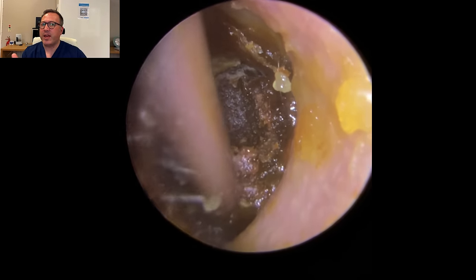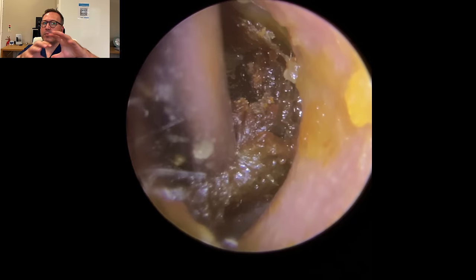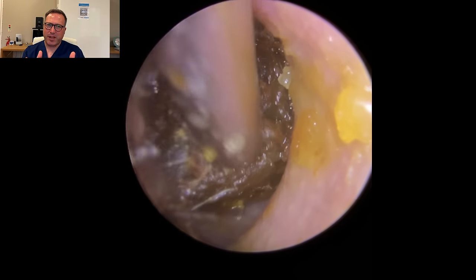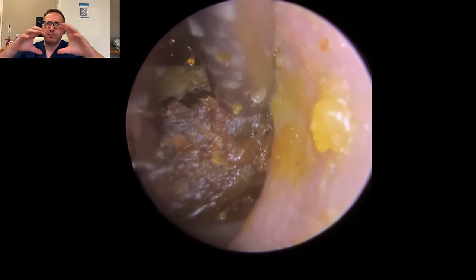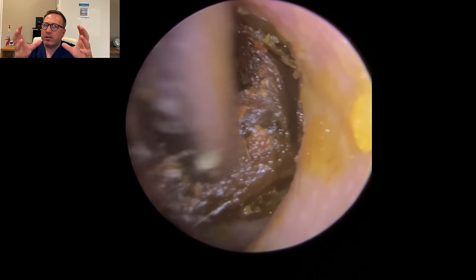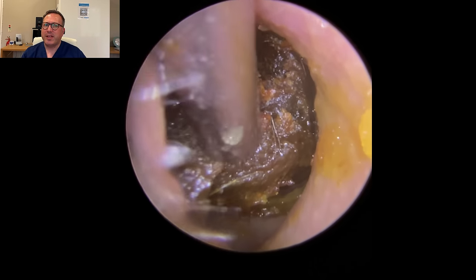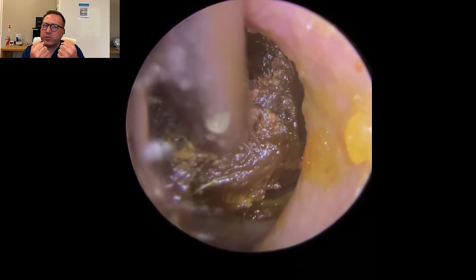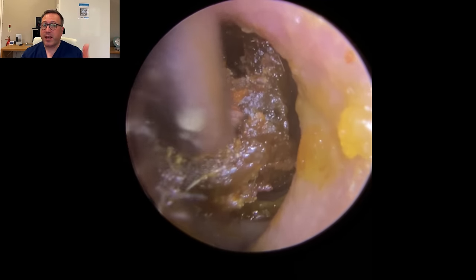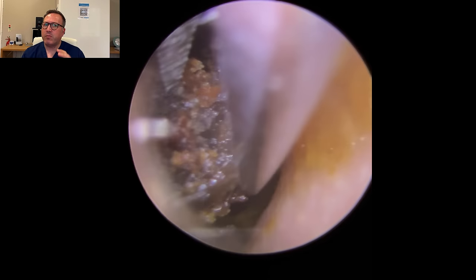You can see as we get the suction on here, how it's all getting pulled into the Zolna tube. Now what we've got here is one hard block of wax. Remember the sleeve of dry skin around the outside edge - what's happened is it's dried the outer layer of the wax, so you've got this slightly more mushy wax in the middle and this really hard layer on the outside. The patient did experience a lot of hearing issues, understandably with this amount of wax in the ear, but also a lot of itching in the ear canal, which is due to that dry skin and the movement of the wax on top of it.